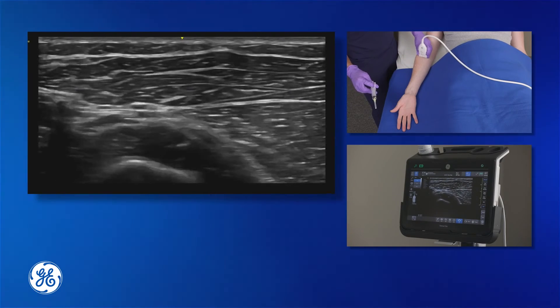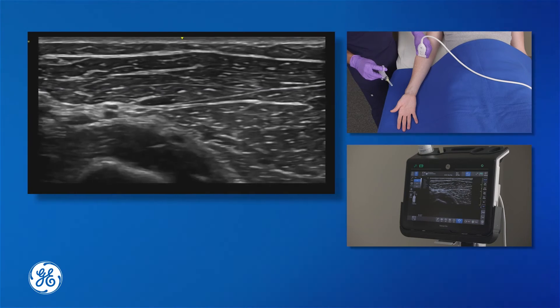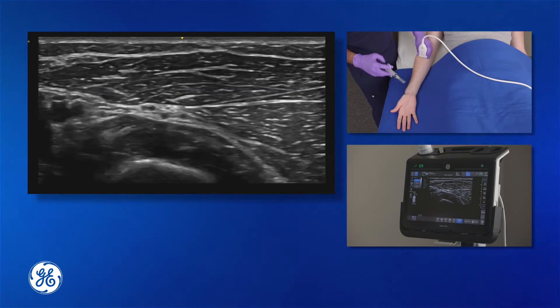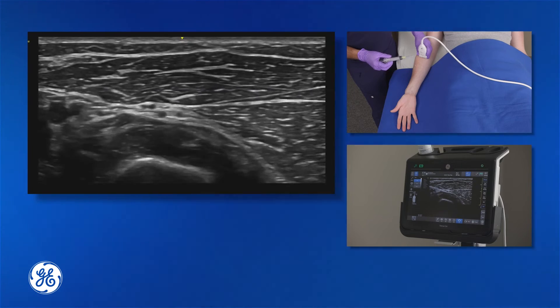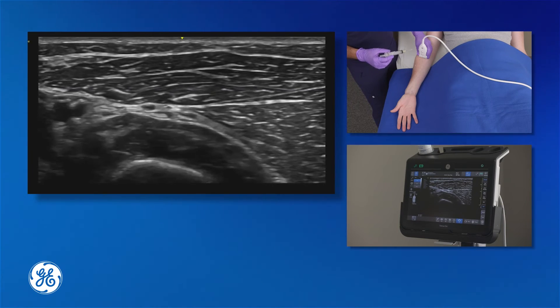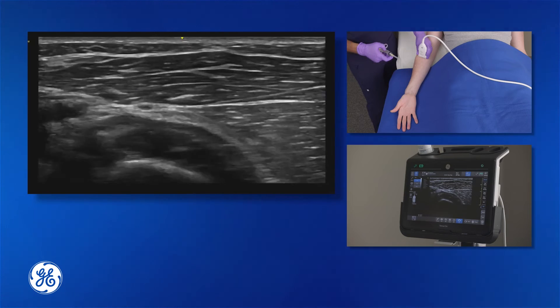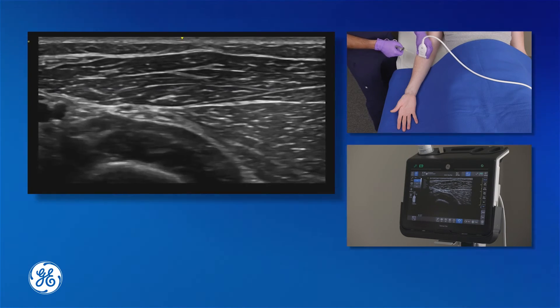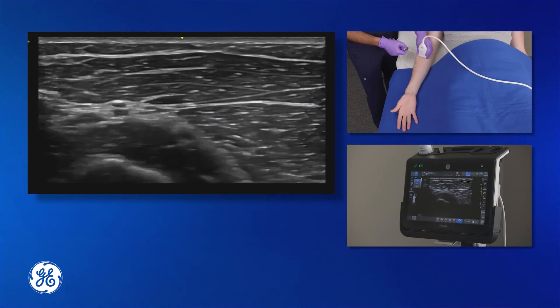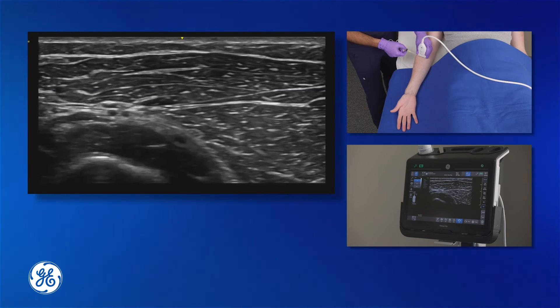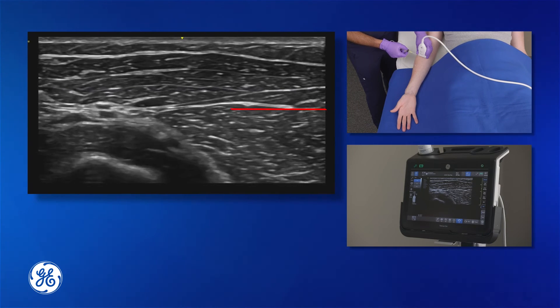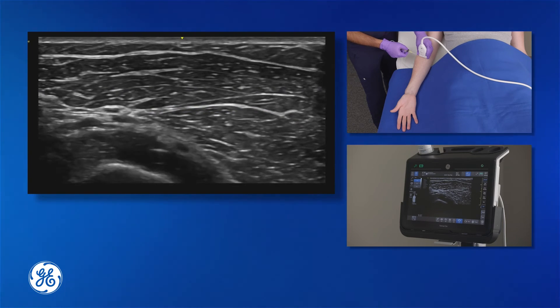Maintaining the nerve in cross section on the screen allows for positioning of the needle in the longitudinal direction, which allows for the easiest visualization of the needle. This is different from bringing the needle in perpendicularly, which does not allow for that level of safety margin. When you bring your needle in using the longitudinal approach, it's oftentimes tempting to place the needle right where the transducer contacts the skin, but it's often easier to drop down a centimeter or two and bring the needle in longitudinally underneath, which gives a nice straight view of the needle as it approaches the nerve.